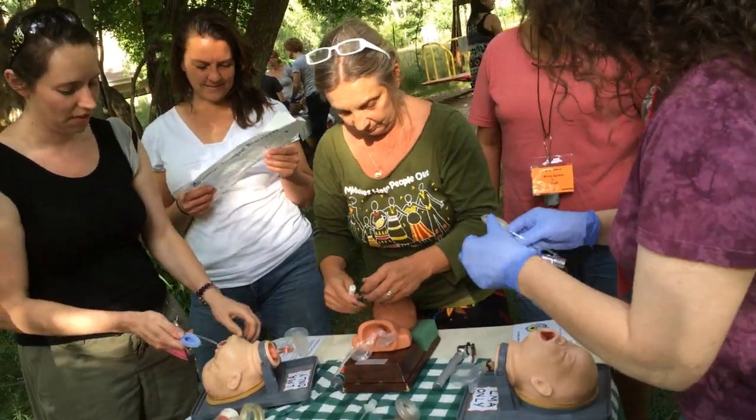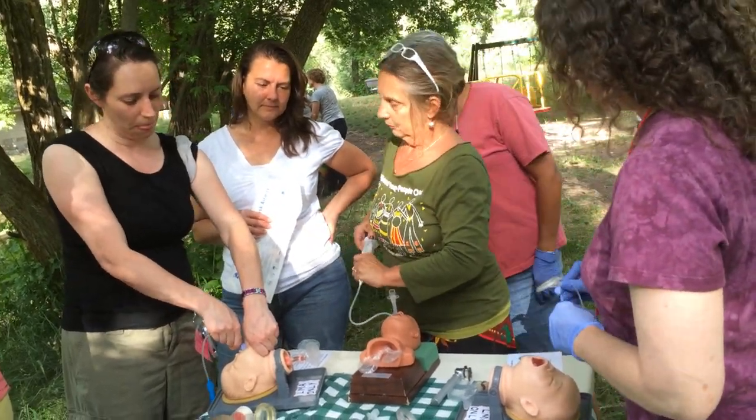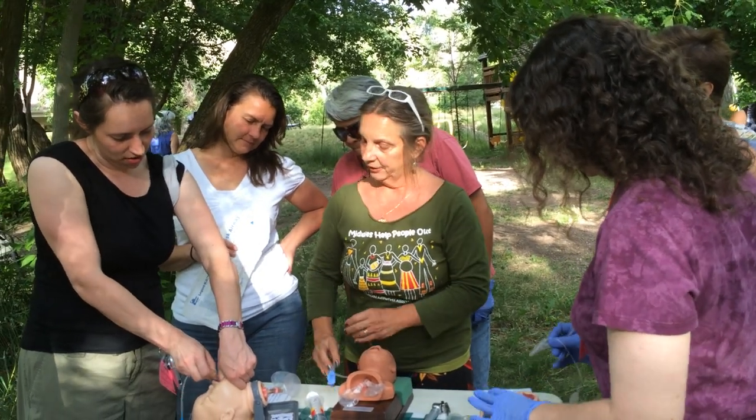Okay. So let me. Okay. Pull up the tongue. Get this in until you feel firm resistance, right? Yep.